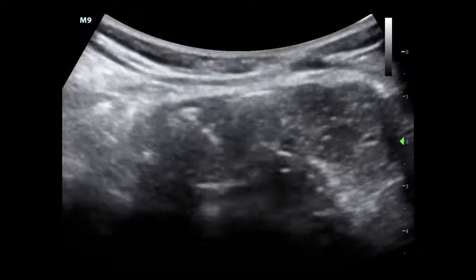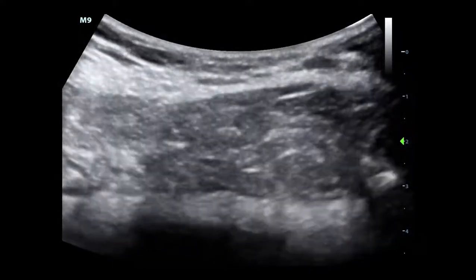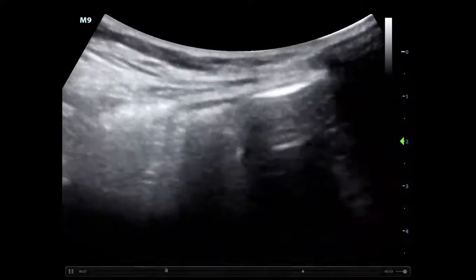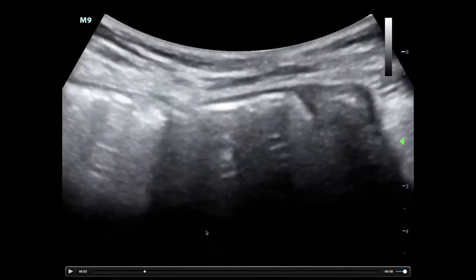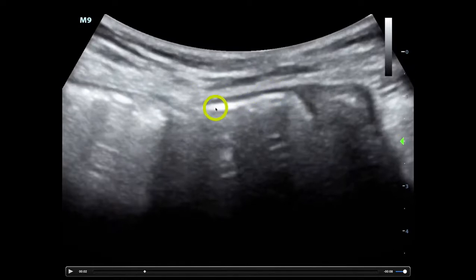Now it's important to understand what a false positive enhanced peritoneal stripe looks like. If you see any kind of hypoechoic layering above what you think is the peritoneum, it turns out that that is not an enhanced peritoneal stripe. This is actually air within the bowel lumen, and this is probably bowel wall right here.